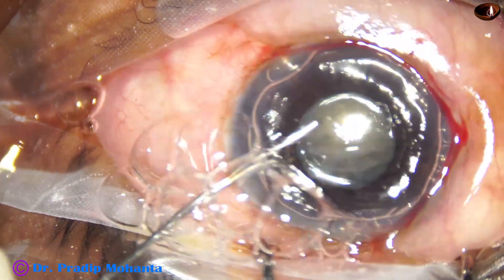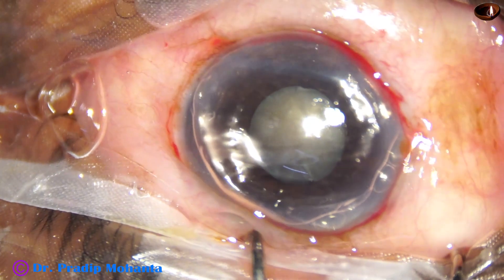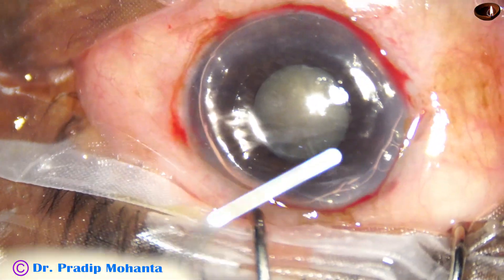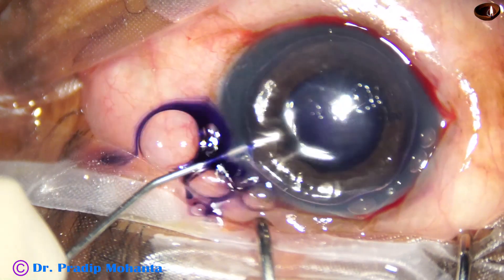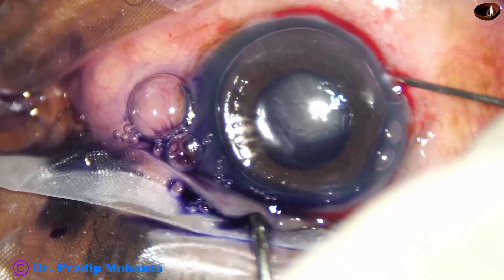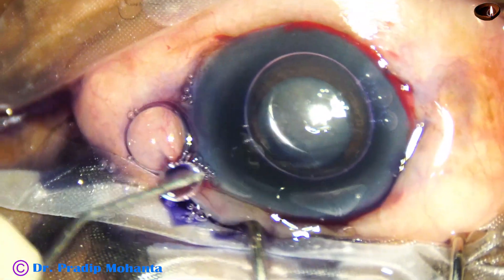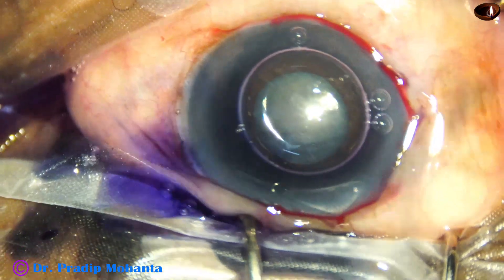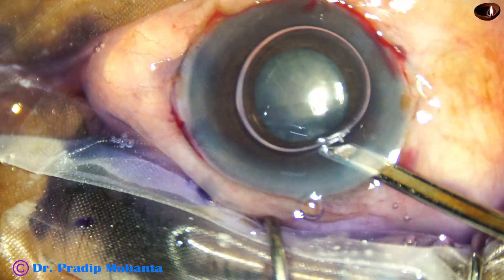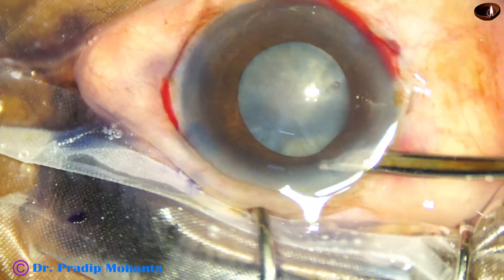If the cataract is grade 3 or grade 2, we may opt not to use a pupil expansion device, but in hard cataracts we should do a rhexis of adequate size and visibility should be good throughout this surgery. So my plan in this case is to use a pupil expansion device, and that is B-Hex.